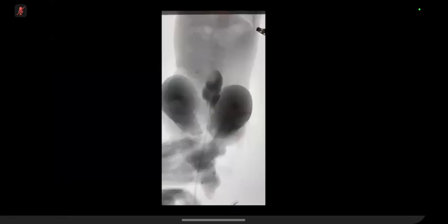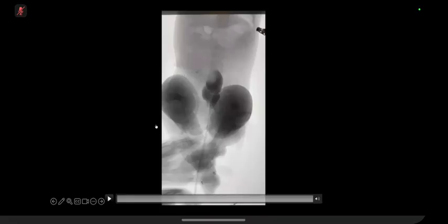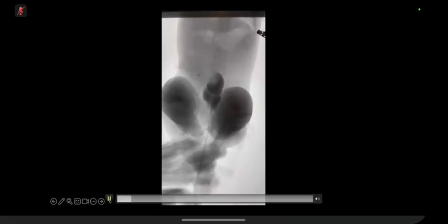So this is, as you said, hydrostatic reduction. I'm just trying to make your scenario more feasible for you. That is the next step, so please try to explain this. I will try to run the video again and again.